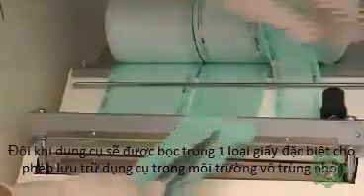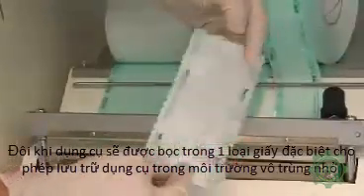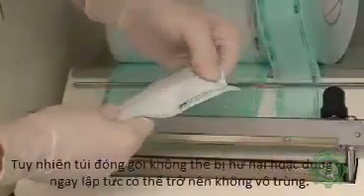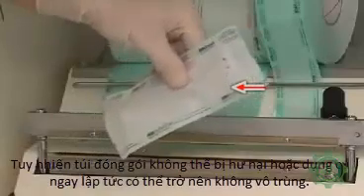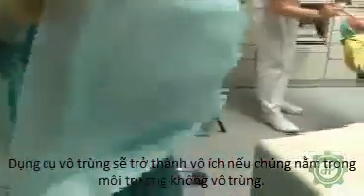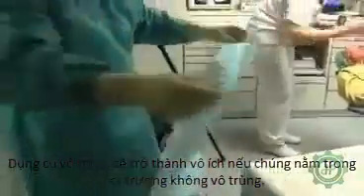Sometimes the instruments are shrink-wrapped in a special paper foil that allows for short-term sterile storage of the instruments. However, the package cannot be damaged or the instrument immediately becomes non-sterile. Sterile instruments are useless if non-sterile covers are used.